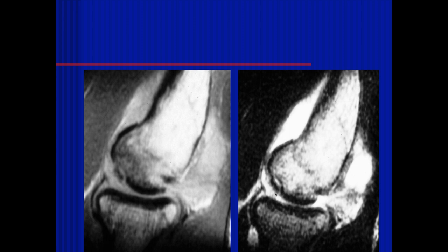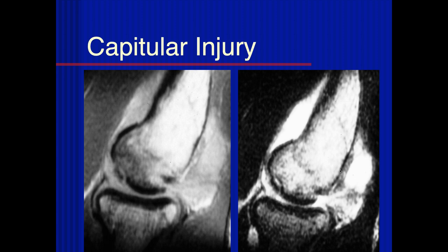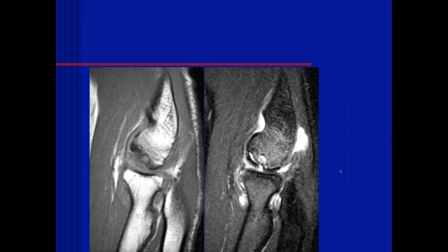So you can see if the cartilage is intact. You want to determine the cross-sectional area or the length of the subchondral bone marrow edema. And also you can see there's a defined subchondral fracture here, with fluid going deep to the subchondral bone. So this is really an unstable little fragment, and you need to get the size. And then obviously there's hemorrhage into the joint space with the big effusion. So that's an acute capitellar injury. As opposed to this one, Ashu, what's this one?